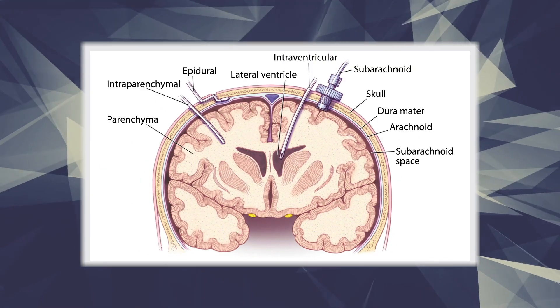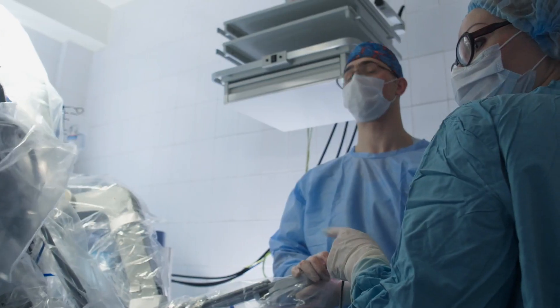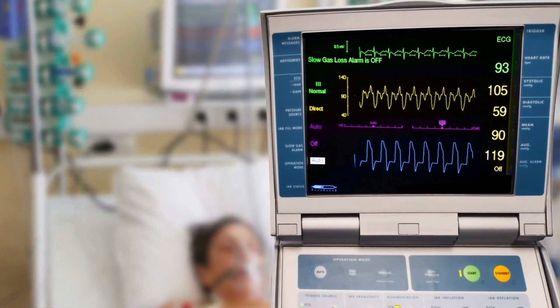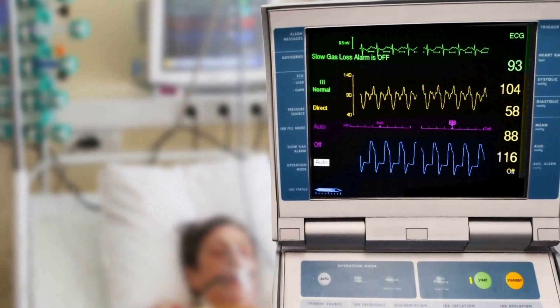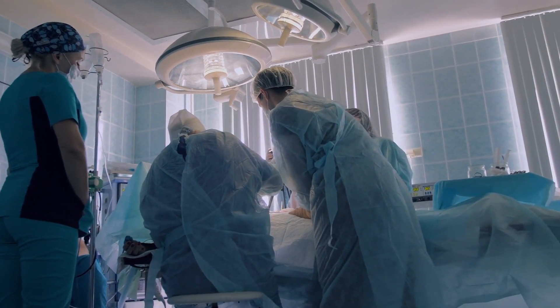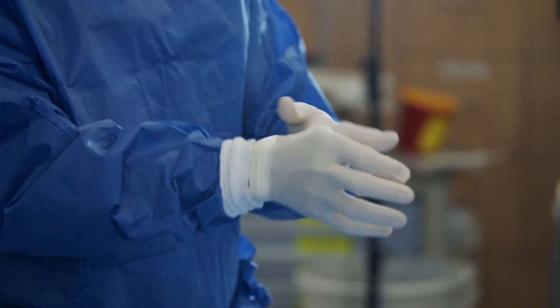This kind of monitoring will usually only be performed on a neurosurgery unit or intensive care unit. Sometimes the bolt will be inserted in the emergency department of a major trauma centre. This will always be done under sterile conditions so that we can reduce any risk of infection. For the purposes of this video, we'll discuss how one of these bolts is inserted into a patient who suffered a major trauma and won't be conscious — they'll already have a lot of sedation and pain relief on board.